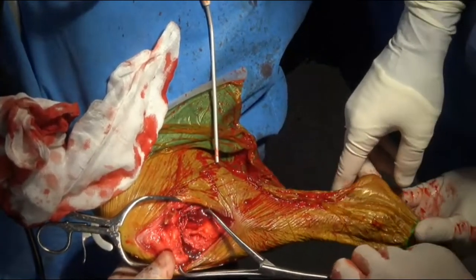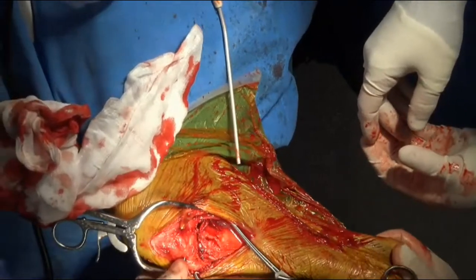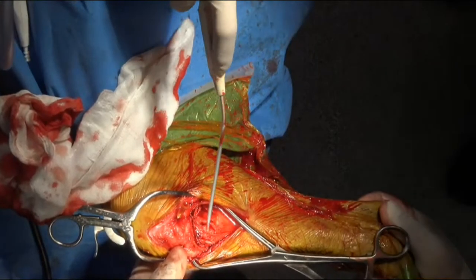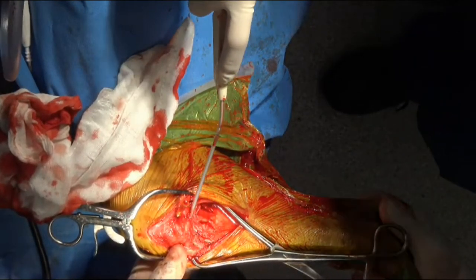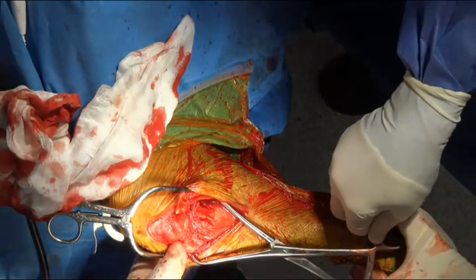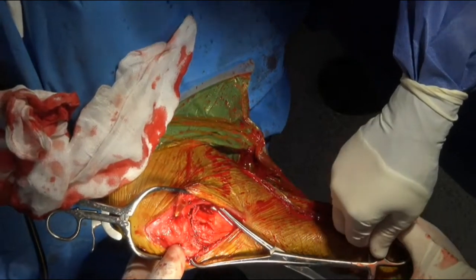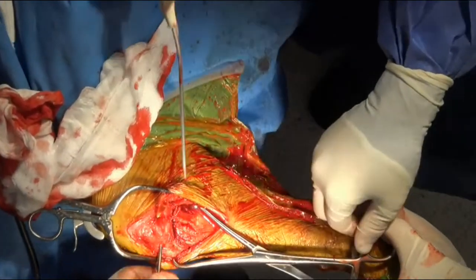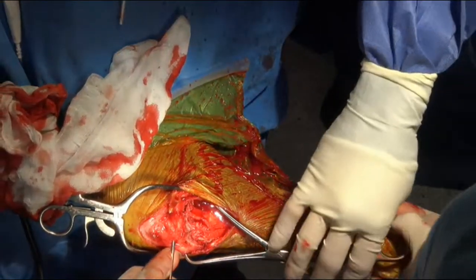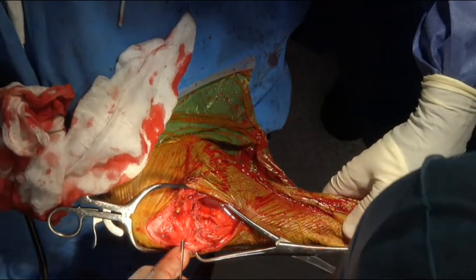Can we have the speed box, Jess? Just clamp that down here. Just suction and then clamp it. You want just suction and clamp. Can you clamp that down here, sorry? Okay. All right. Okay, just hold that hock there, right there. Okay, a bit more. I'm pretty happy with that.